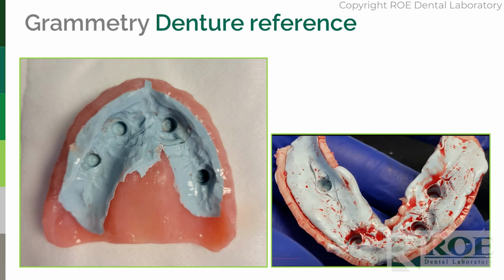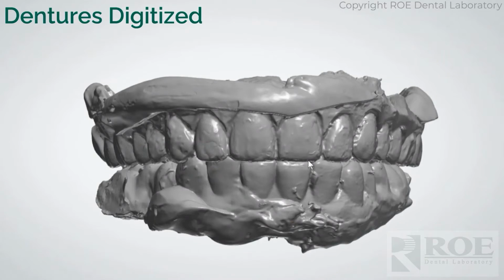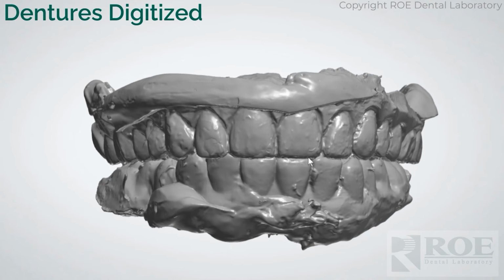Right? Now you notice there's no screws or tads. We don't need them. This is going to be an iOS impression of the healing collars outside the mouth in the denture. All right, you've captured upper lower. Next step, scan the denture 360, scan both of them. Okay, what we end up with is this. Now you should also scan the denture outside the mouth.